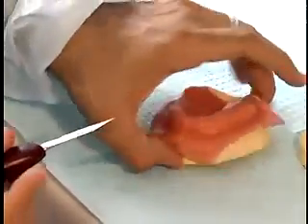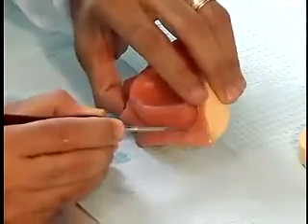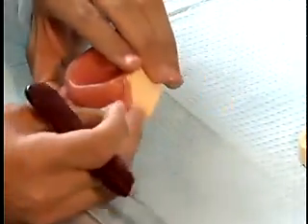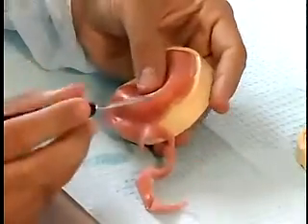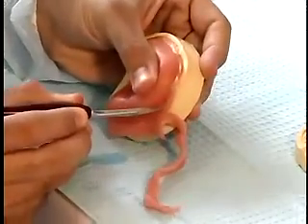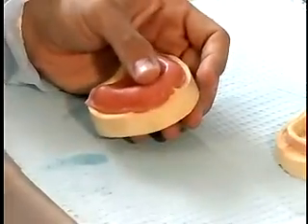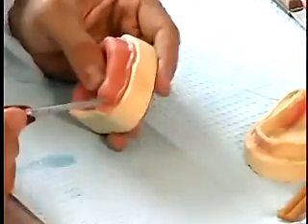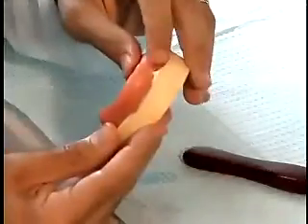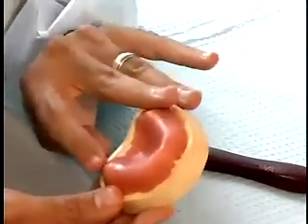Trim the triad to the depth of the vestibule labially and buccally and to the most posterior extent of the impression. Take care not to create a thickness of less than 2 mm. Shape the material prior to curing, as it is much easier to smooth it when uncured.